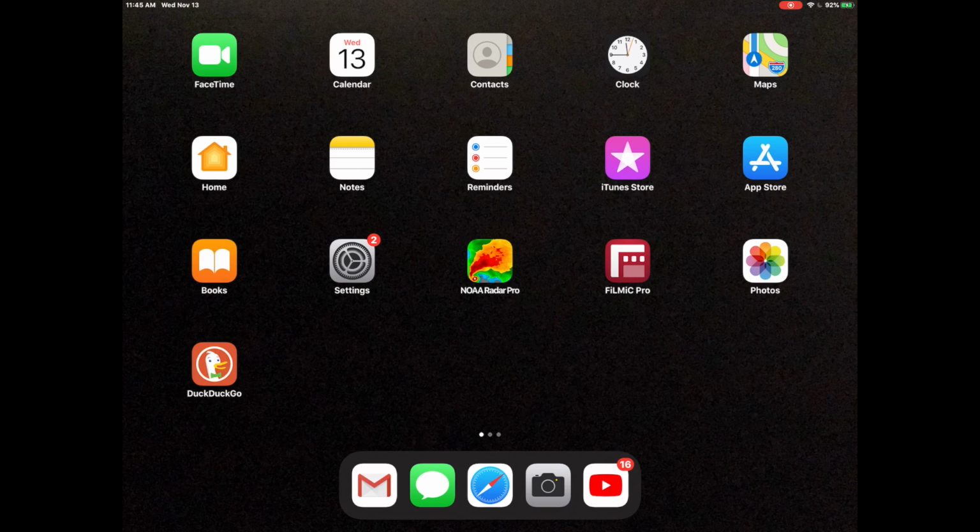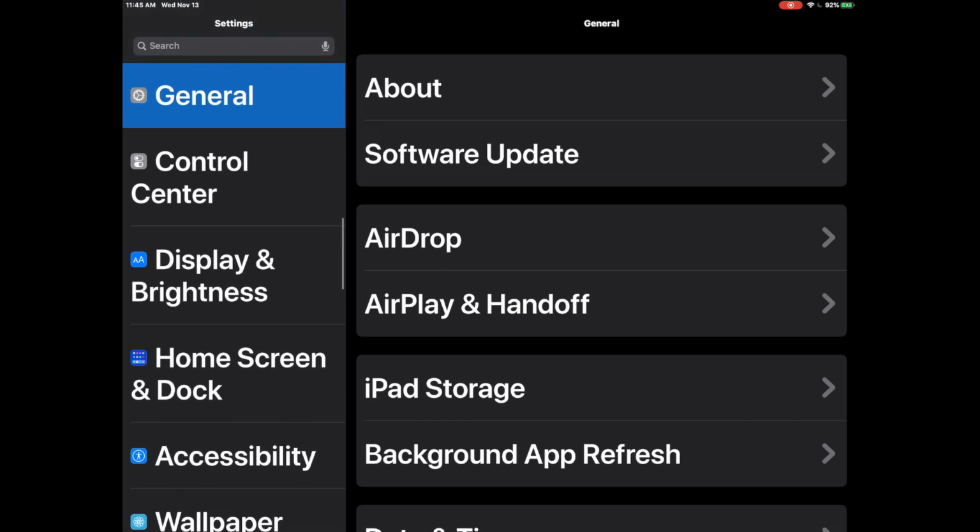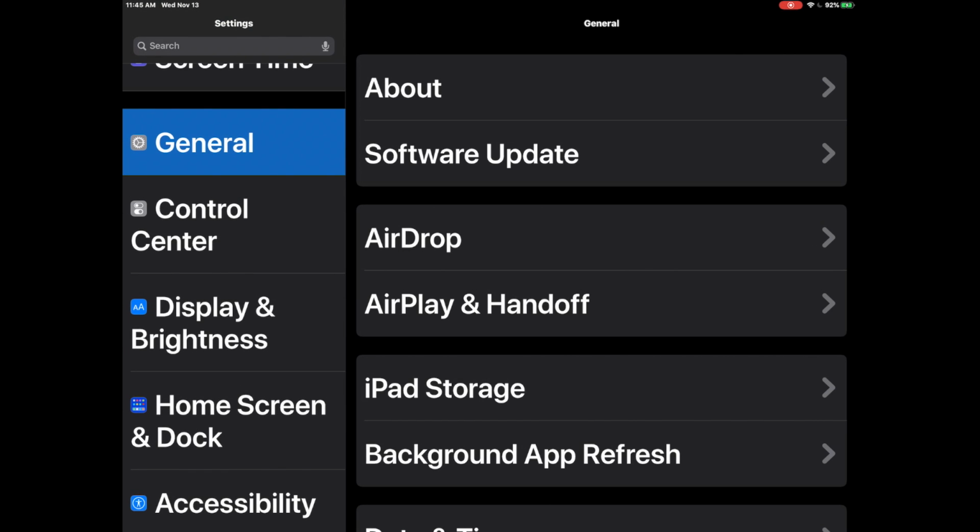As promised, we're going to get into the nuts and bolts of setting up the low vision magnifier on your iOS device. iPhones, iPads are pretty much the same. We're going to start by going into settings, and then from settings we're going to set up accessibility. In previous versions of the operating systems, you would go to the General tab, find the accessibility folder, and find your settings there.